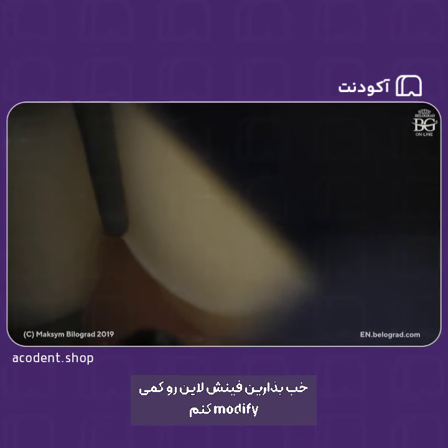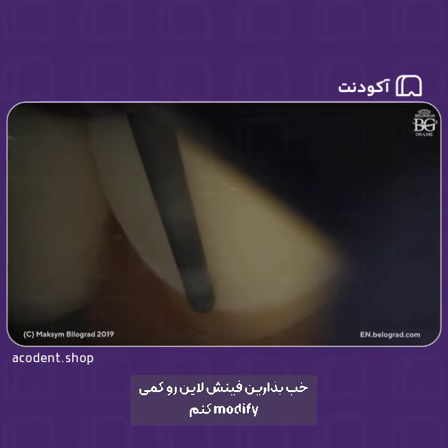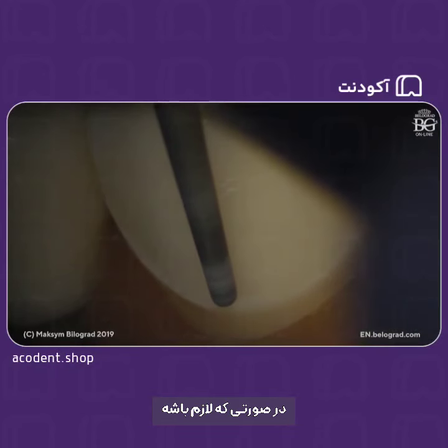Okay, so let me just modify or improve the finish line if it is necessary.